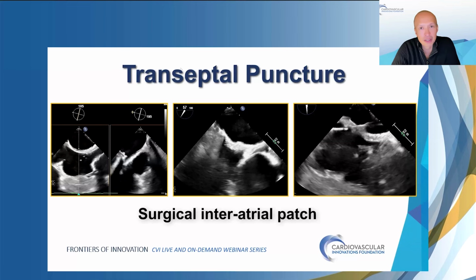Abdullah, your points about the transeptal location are very important, because we have a single curve system. We don't have double curves, so you can't correct an aorta hugger if you needed to.